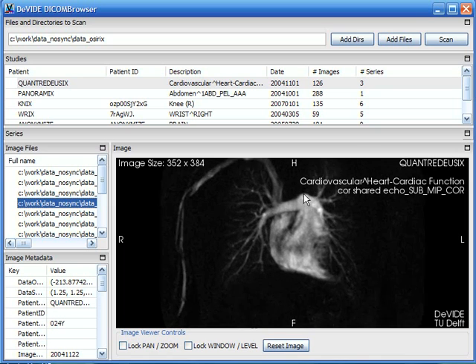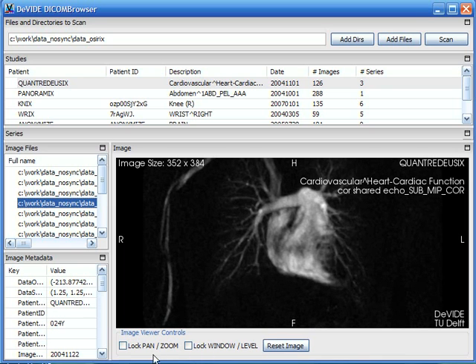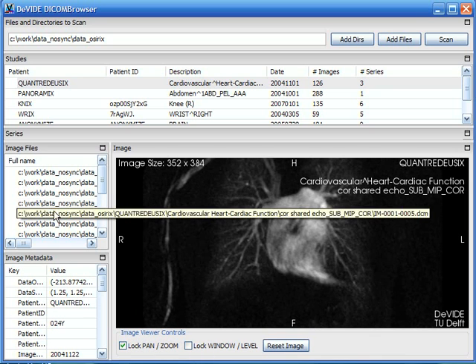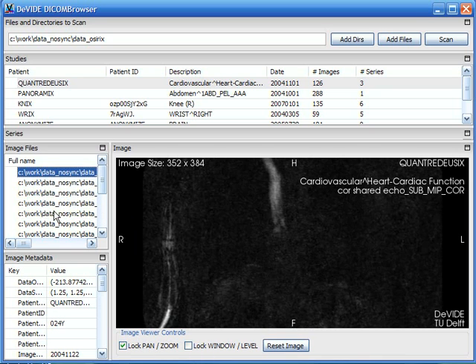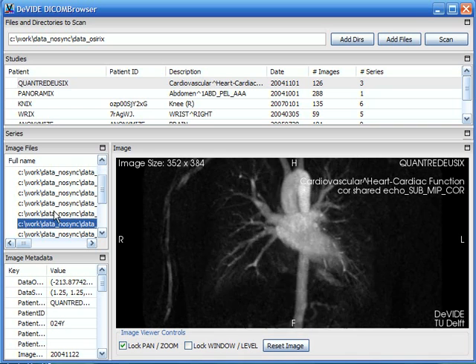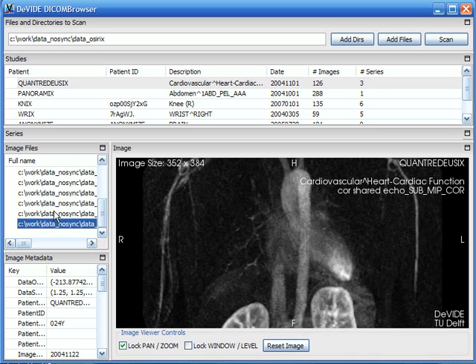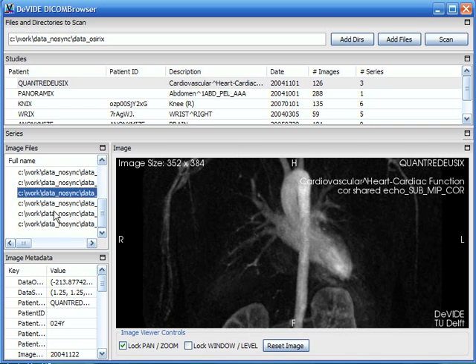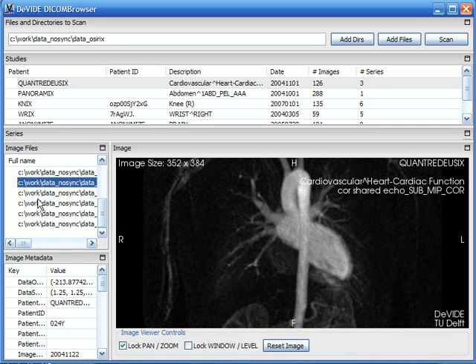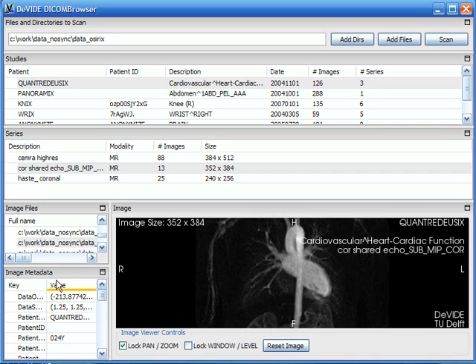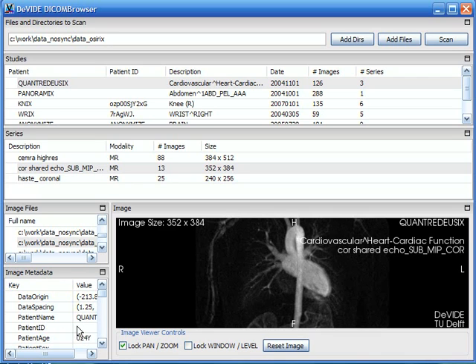Just zoom in there and just lock that. So in this way I can scroll through this complete data set and for each and every data file I can also see the DICOM specific metadata down here in the metadata box.